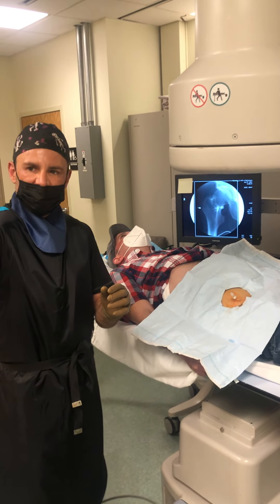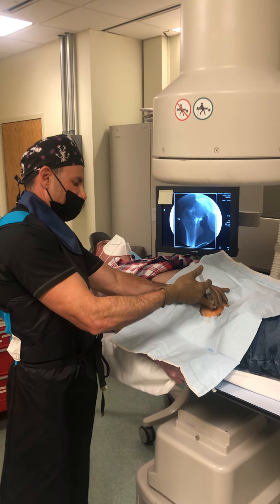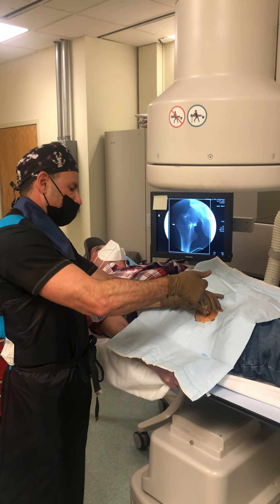Now we have our PRP and we're going to split the dose. We're going to inject half right along the capsule. You're going to feel a ton of pressure.